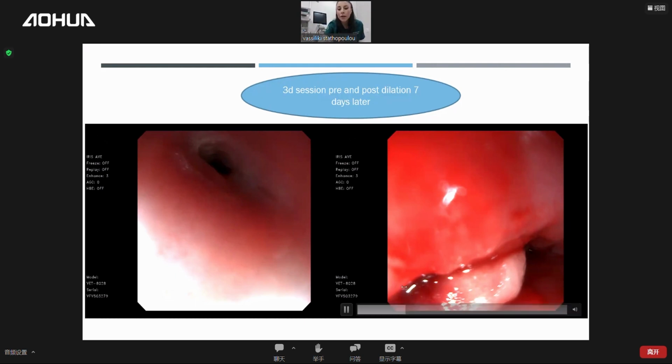Now, in terms of esophagitis, do you use cortisone after each dilation? Not after each dilation, but yes, at the side of the stricture, we could instill cortisone peripherally with the needle that I have shown you earlier. Okay, and we also give cortisone after, even if you have such a severe esophagitis.